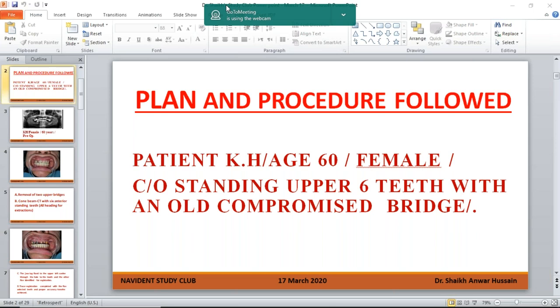First of all, thank you for the question. I want to make clear that I have done very few cases in my life with static guidance. Most of the cases were just the study. I was using, and I am using, Simplant to find my way through, even if it's a single tooth, three implants or a full mouth. And I always make landmarks, a tooth or a root or a ridge eminence or a socket, and I always count distances from them. That's the way I always try to place the implants. I am used to it.